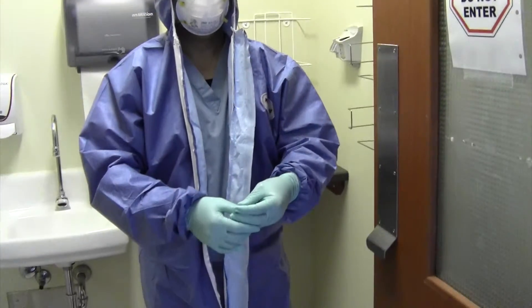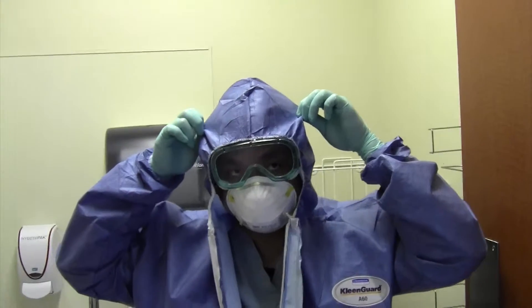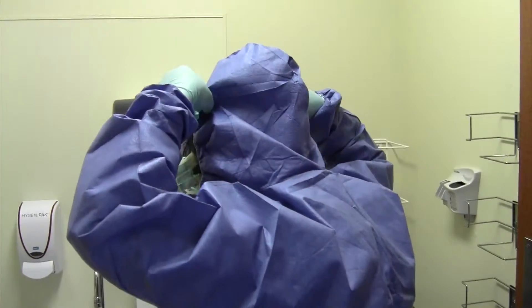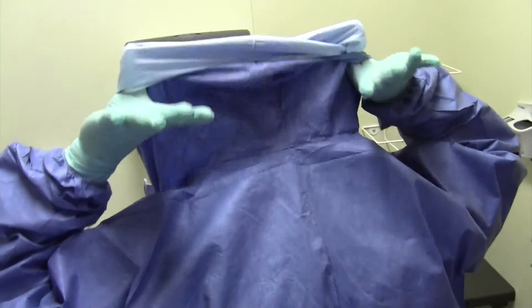Sanitize gloves with alcohol-based hand rub. Step 8: Pull back coverall hood. Avoid contaminating the back of the head with the outer surface of the hood. Do this by grasping the hood on the outside and flipping it back with your hand so the inner surface of the hood is exposed.